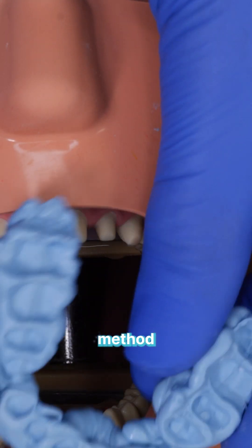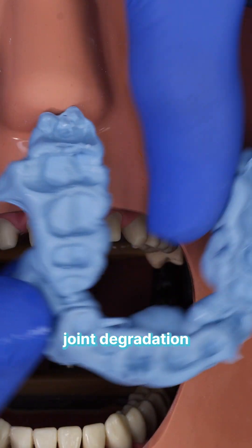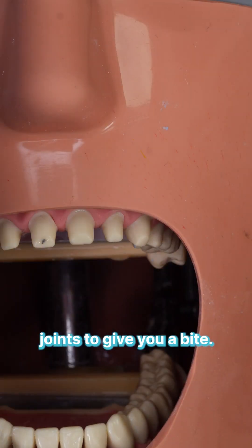It's a particularly useful method when you have unstable joints. If there's some joint degradation and you can't just rely on a leaf gauge and the pressure of stable joints to give you a bite, this technique ensures accuracy.